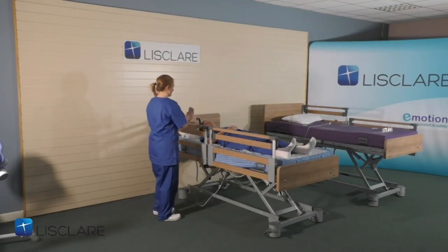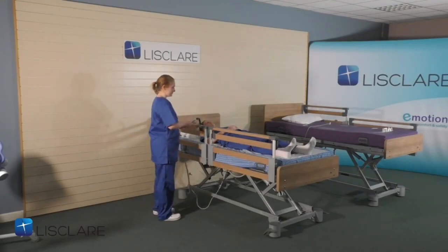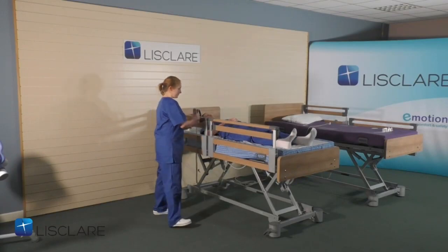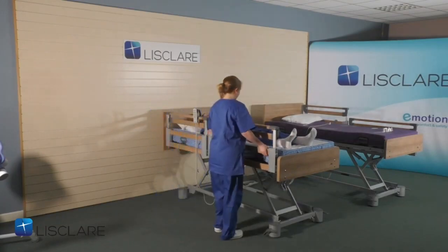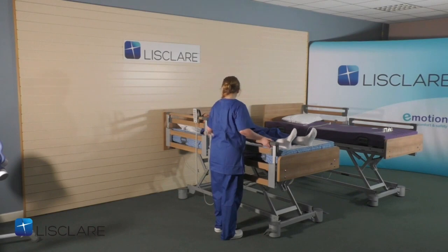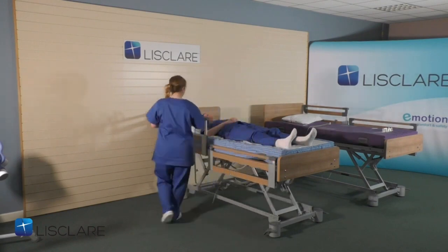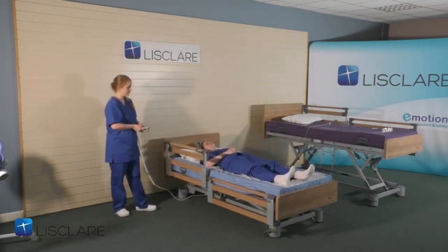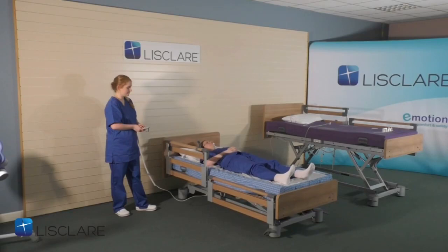Okay. Now, obviously, size is the issue. So you can see the size of the footprint of the bed needed. The bed actually comes, as you can see, either 246 or 253, and 253 is required to be used as a partner bed. But that's the footprint needed for the room, okay?